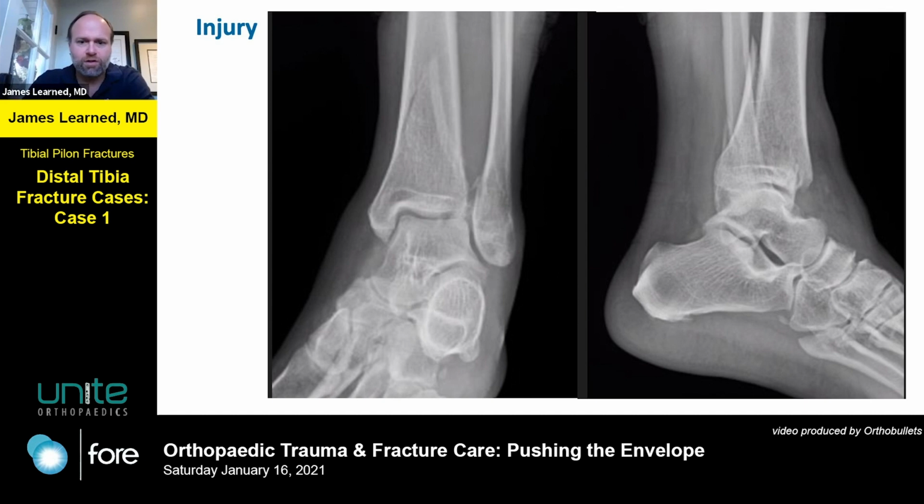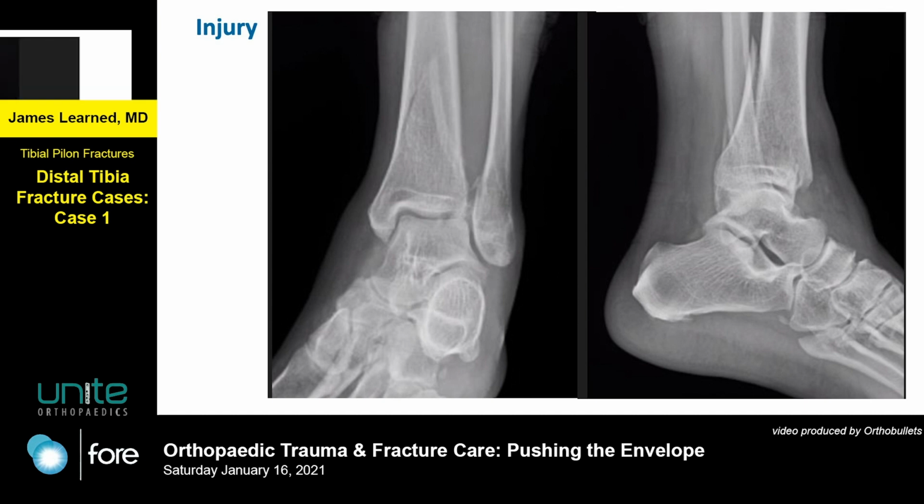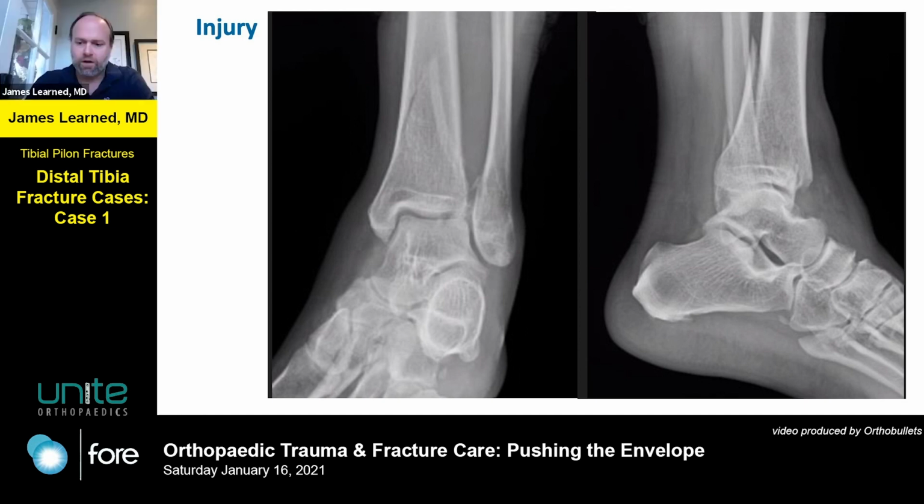Would you like me to keep going, Jeff, on another case? Yeah, let's just do one more. Perfect. All right, here's a little more typical pilon fracture.